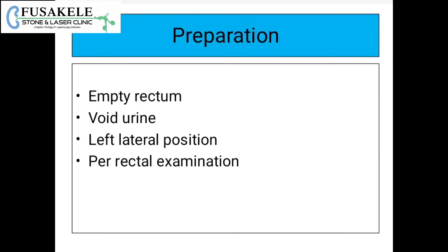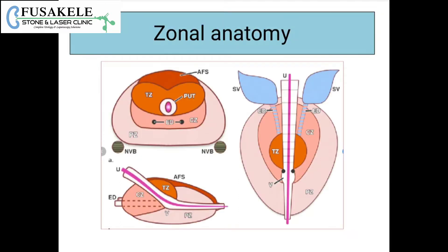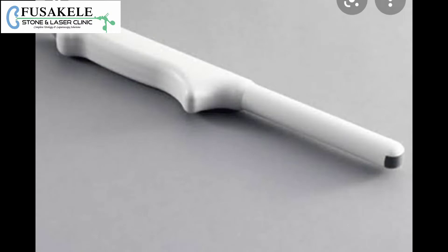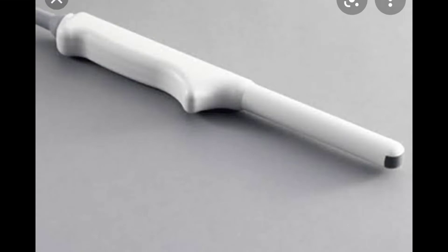As part of the preparation, the patient's rectum is kept empty and the patient voids urine beforehand. The patient is kept in the left lateral position, a per rectal examination is done, and the zonal anatomy of the prostate is kept in mind. I am going to use a SonoSite M-Turbo machine with a C8 probe.